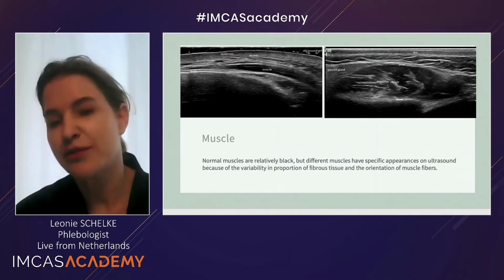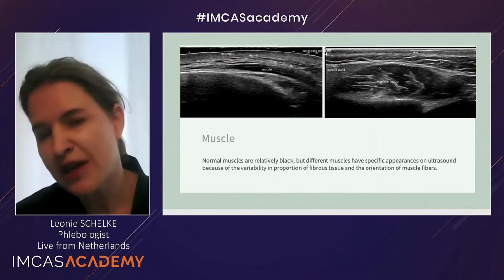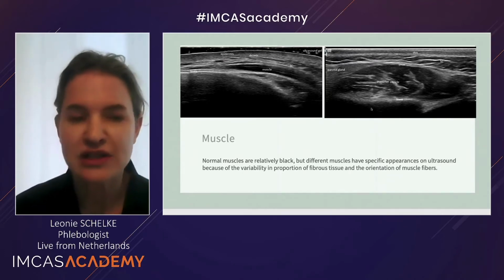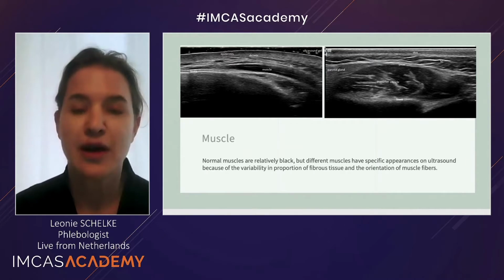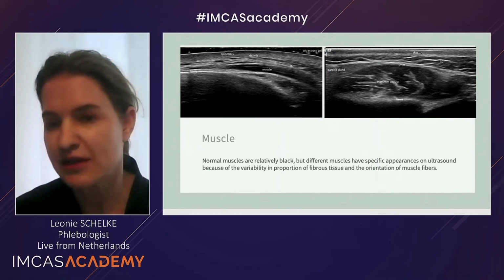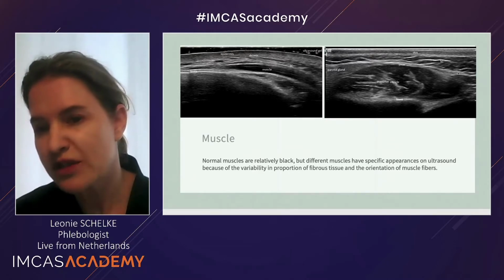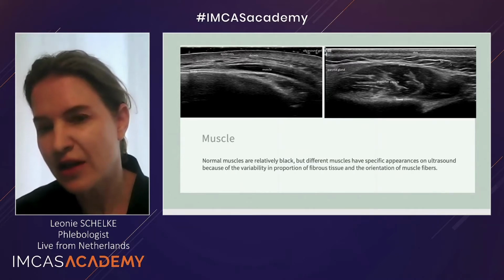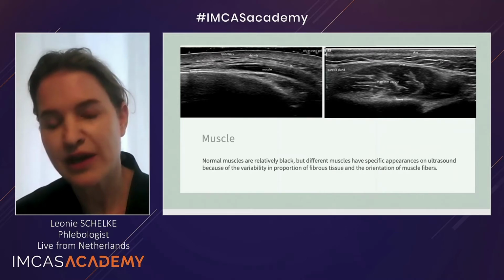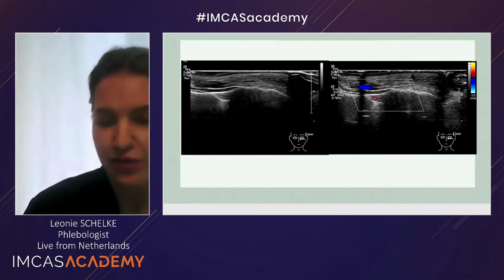The masseter muscle and the temporal muscle have the same dark background, but they are so big that they have septae in them. Then of course it's just a matter of applying layers. Again, we start with the epidermis, this darker layer, then the dermis. Subcutaneous tissue will always look a bit lobular, as the fatty lobules look like this. Then SMAS, masseter muscle, and here we have this cloudy homogeneous area, which is your parotid gland.